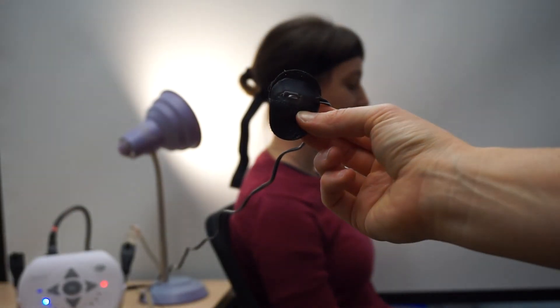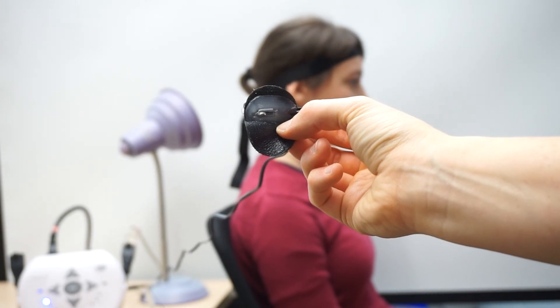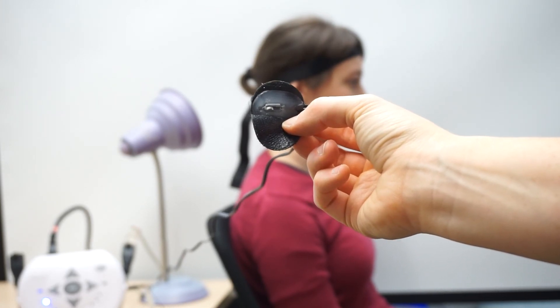When I tilt it back, the light's on. When I tilt it forward, the light's off. And that is the Tilt Switch by Enabling Devices.